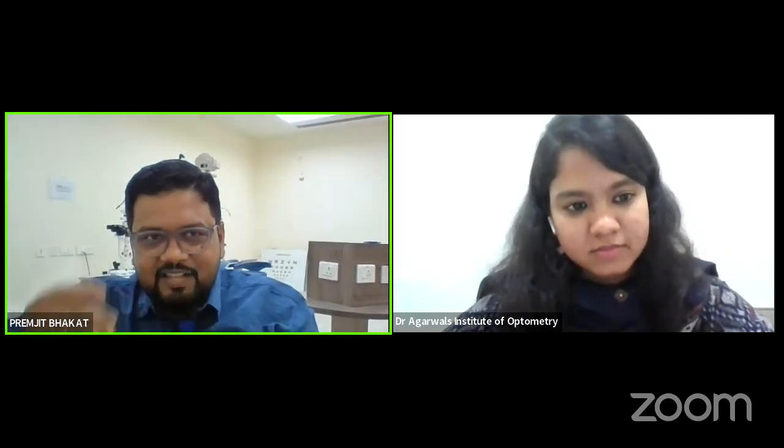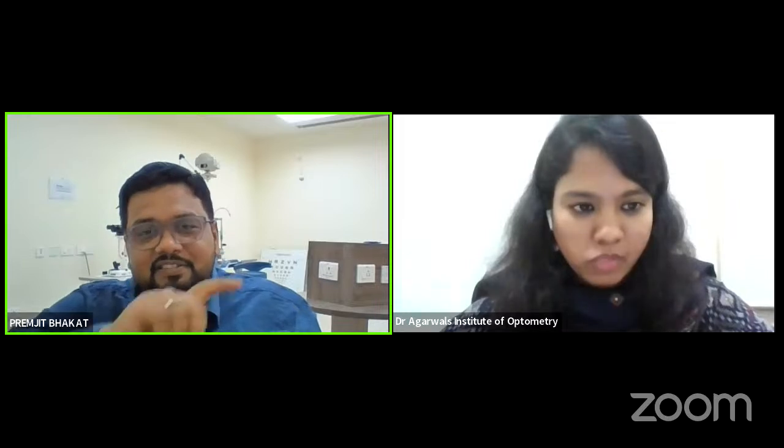So it helps us understand whether this lens, and then what I try next, actually improves over it or not. So fit assessment is the first thing; it ensures the comfort. It also ensures the safety. In one of Deepika's slides, she said if the lens is fitting too tight, there may be indentation marks, especially for RGP, and soft lenses will do it around the limbus, which may be a potential risk later. So safety and comfort are addressed by fit assessment.